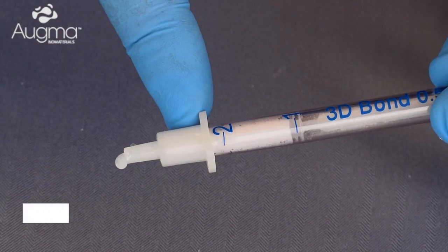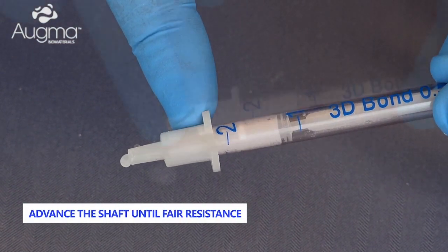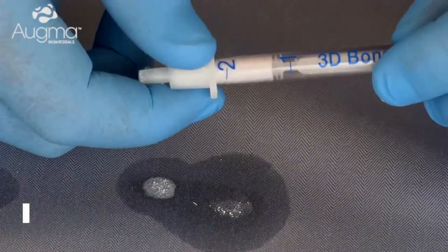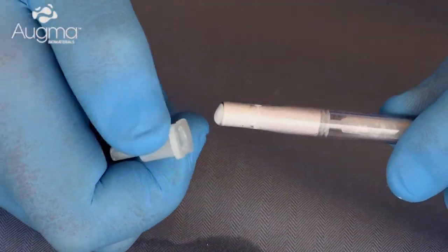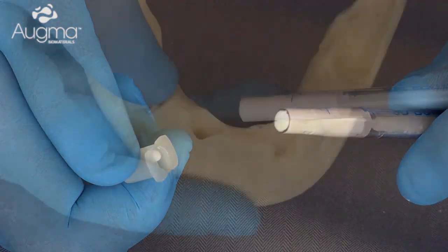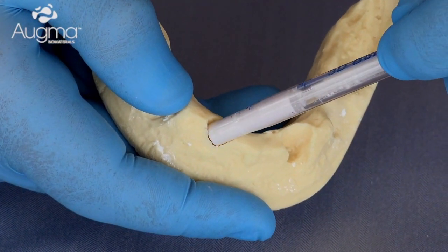In order to expel liquid surplus, we start advancing the shaft forward until fair resistance is noticed. We then remove the 3D Bond driver head, and we are ready to eject the material into the socket site.